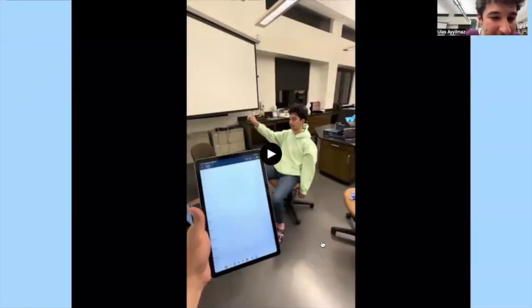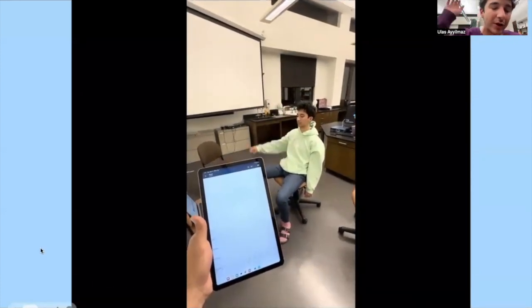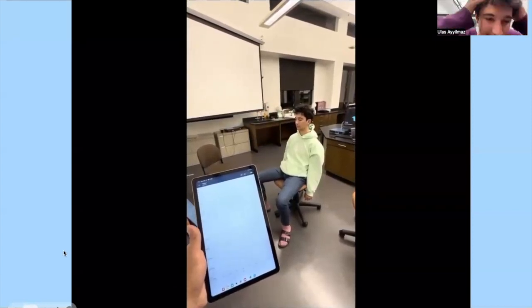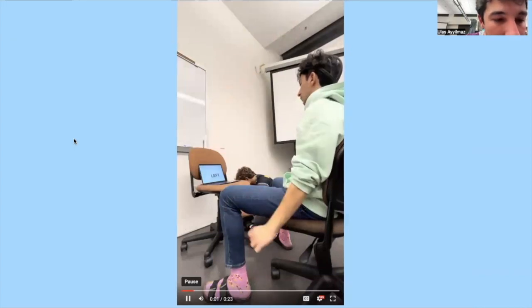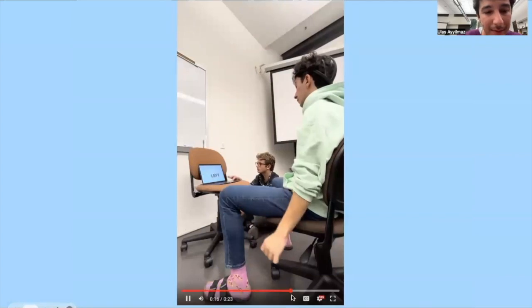Let's play a video. This is how we gathered our data. I was shown right, left, or none, and I'm respectively moving my right hand because I'm being shown right, and my headset is gathering the data. It's collecting the data labeled none at the moment. We can move on, and this is collecting the left. We have slides, and we have a video in the slide. So I'm moving my left hand and collecting my brain waves responding to my left hand, and it's going to switch to right in a bit. Right now I'm moving my right hand.